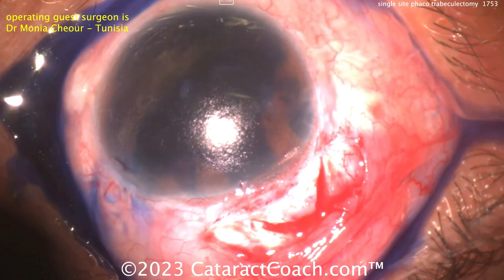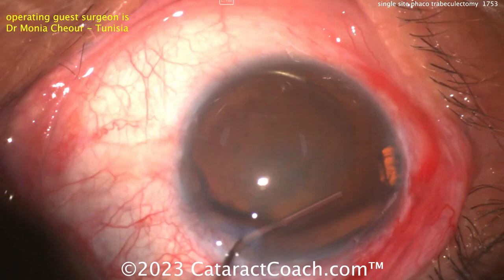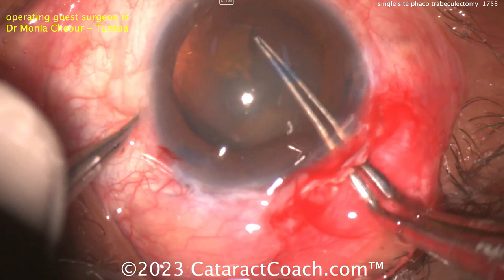Now going to do the cataract. Trypan blue dye — probably always a good idea, dilute that down. You can see a little bit of synechiae there, so viscoelastic going inside — you can probably break the synechiae as well at this time. You can see prior peripheral iridotomies being illuminated there. Entering in that exact same path with the keratome, and now getting the capsulorhexis done.